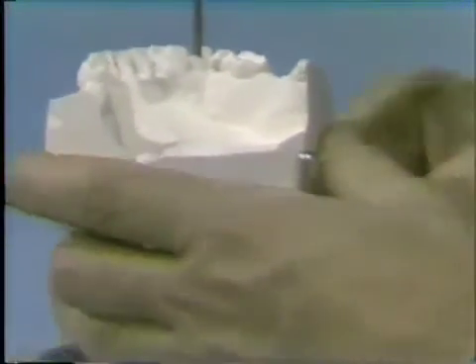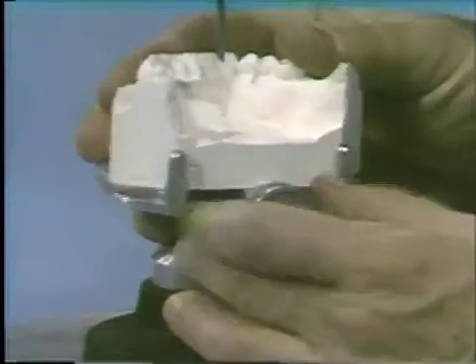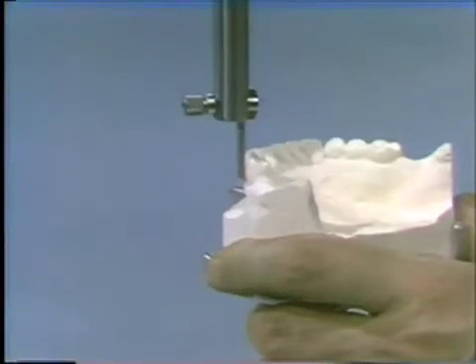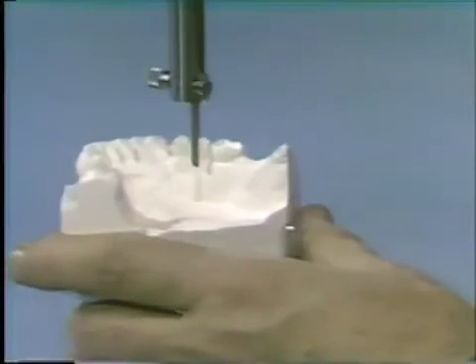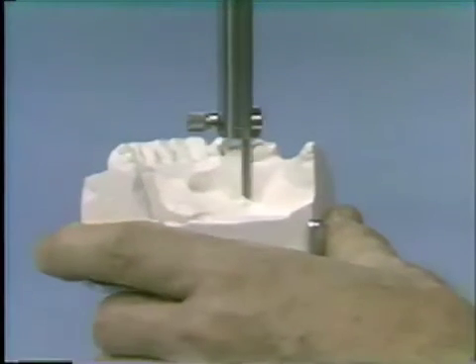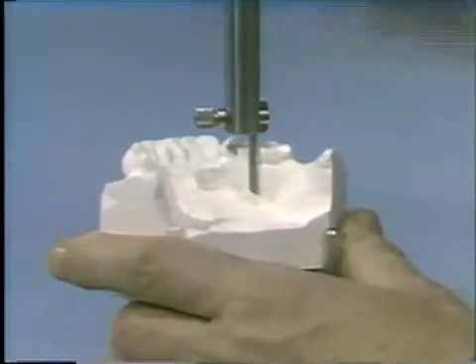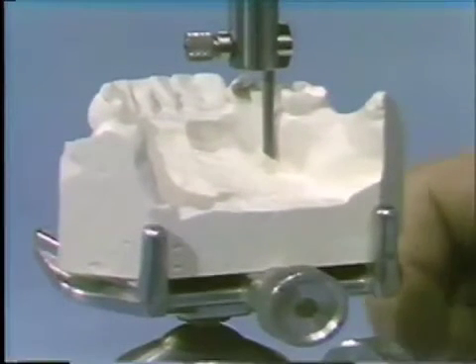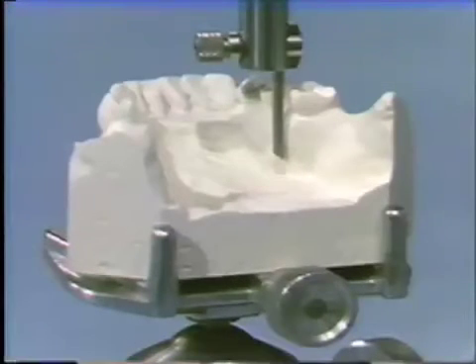We unlock the ball joint and move the cast from side to side, back and forth, into any one of the many positions available, constantly checking the undercut available. We try to get balanced retention on both sides of the arch, check guide plane areas to see where we can produce guide planes, and check undesirable undercut areas to try to eliminate or minimize them. We do this until we finally come up with a compromise position between retention, guide planes, undesirable undercuts, and aesthetics. This becomes our path of insertion and removal.